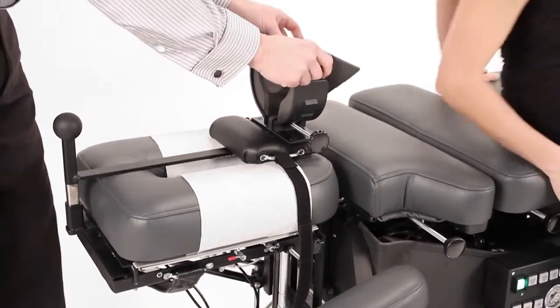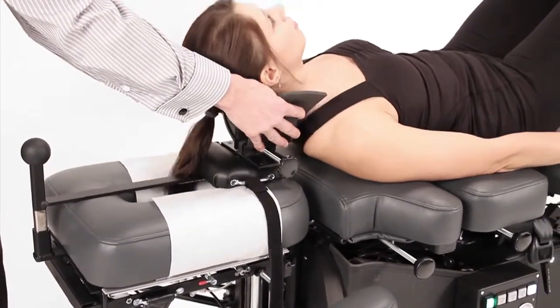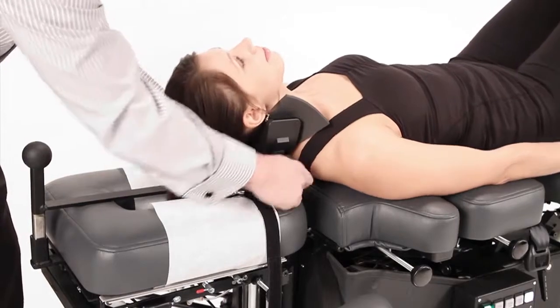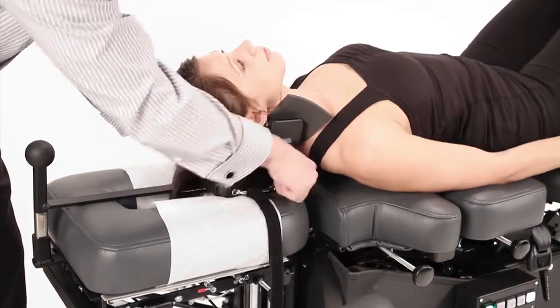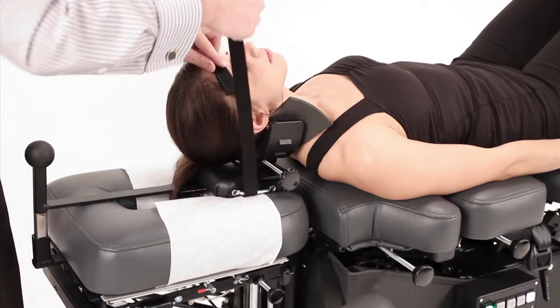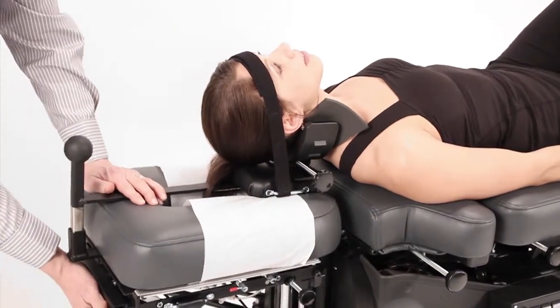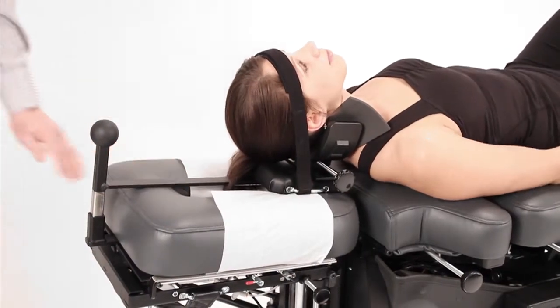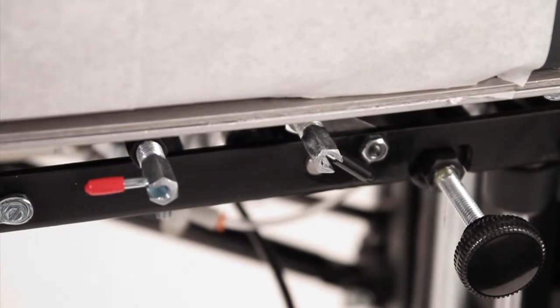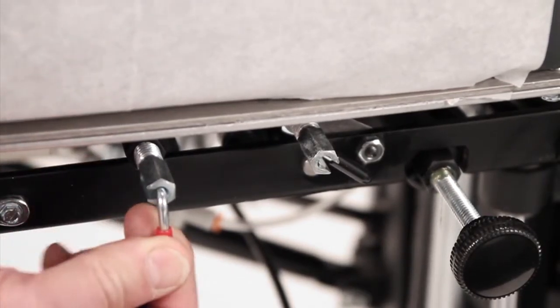To use automatic cervical distraction, gently position the patient's occipital region into the upper inside ridge of the cradle support with the insert pad facing the ceiling. Tighten the tension knob until the patient feels a slight inward pressure. Secure the forehead straps and tilt the headpiece about 5 to 10 degrees. Pull and rotate the red pin located underneath the headpiece cushion. This will unlock the headpiece so that automatic distraction is possible.